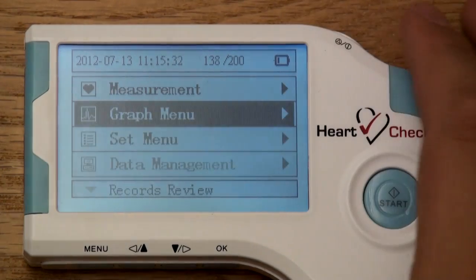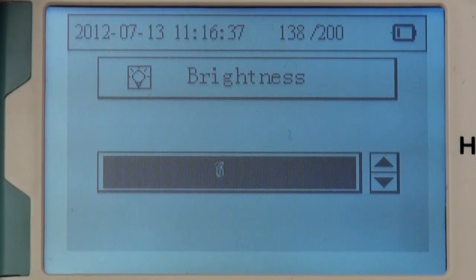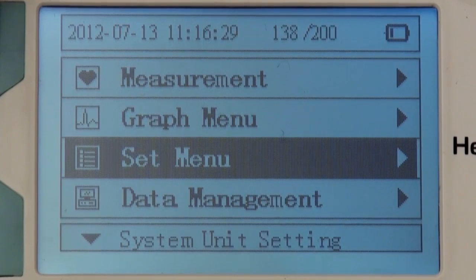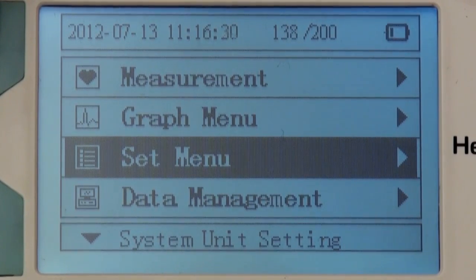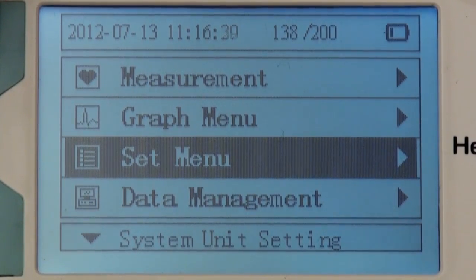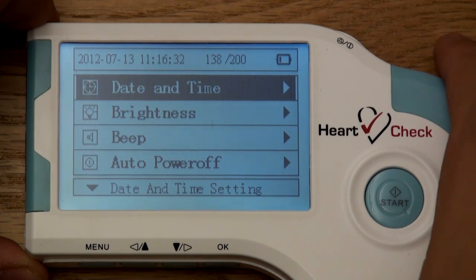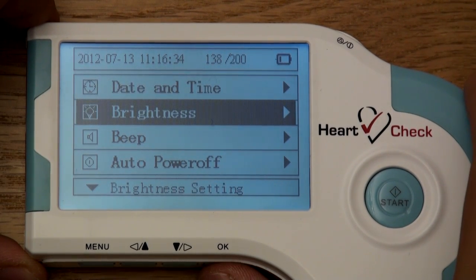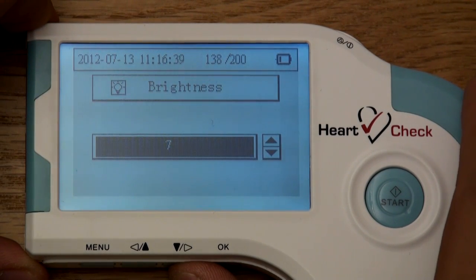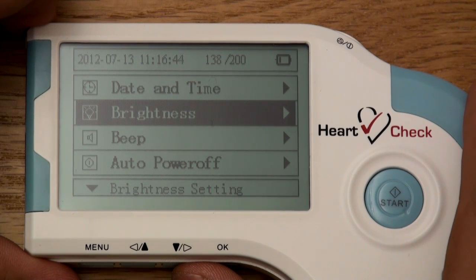Select menu to return to the previous screen. Adjusting brightness. The HeartCheck handheld ECG device also allows you to make other various adjustments. These additional features are located in the set menu category, accessible from the home screen. Simply scroll to the set menu category using the arrow keys, then select OK when set menu is highlighted. Using the arrow keys, scroll to the brightness category and select OK to enter. Here, you can use the arrow keys to adjust the brightness of the device's monitor. Select menu to return to the previous screen.